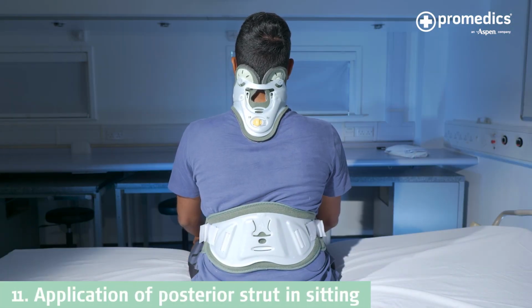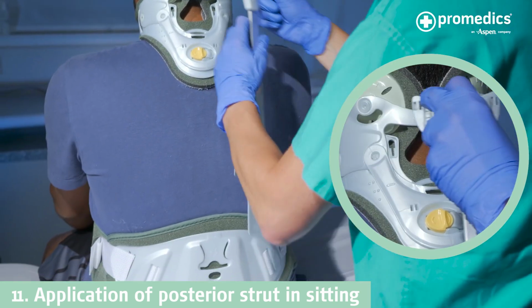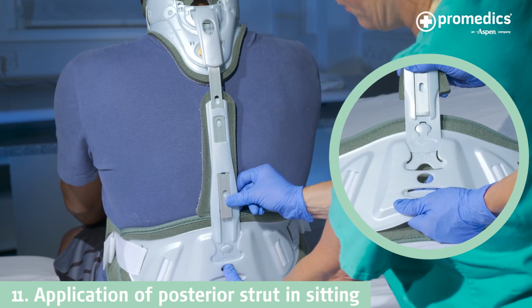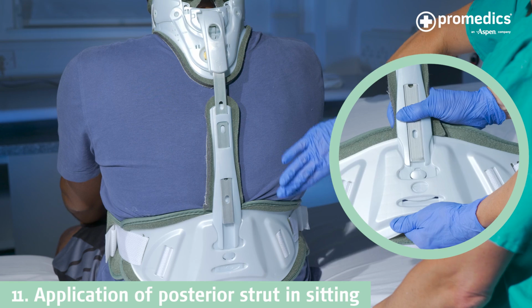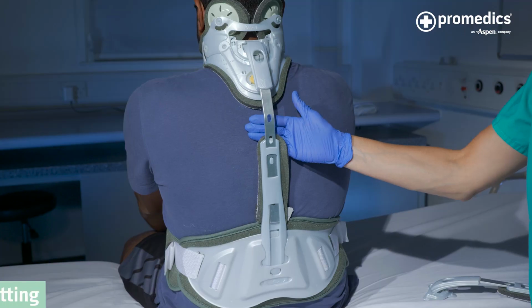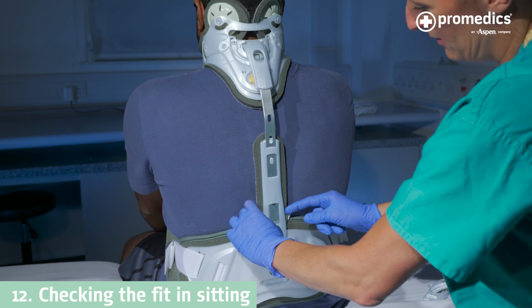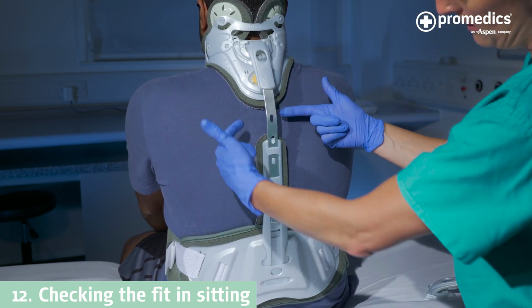To fit the posterior strut in sitting, ensure the strut is adjusted to the correct height and line up the upper section into the slots as shown. Once this is secured, slide the bottom section into the slit and push the bar down until the button clips securely in place. Check all the foam is overlapping the metal and plastic components.